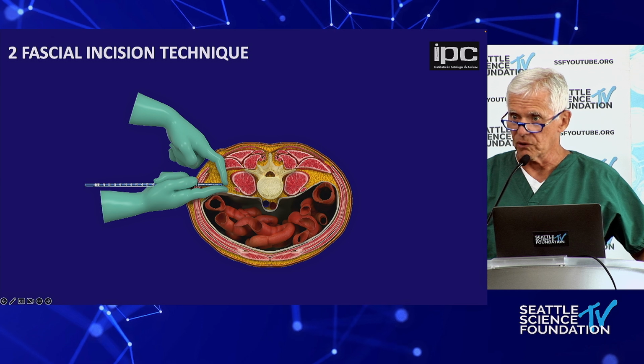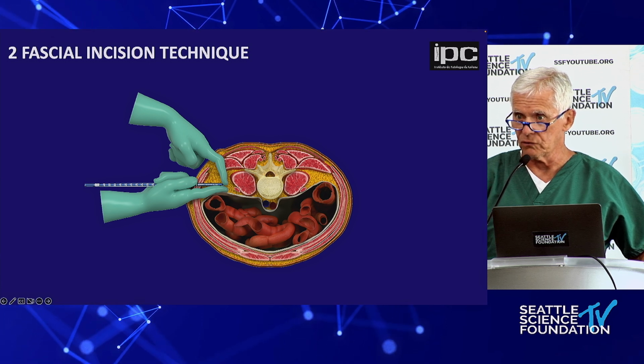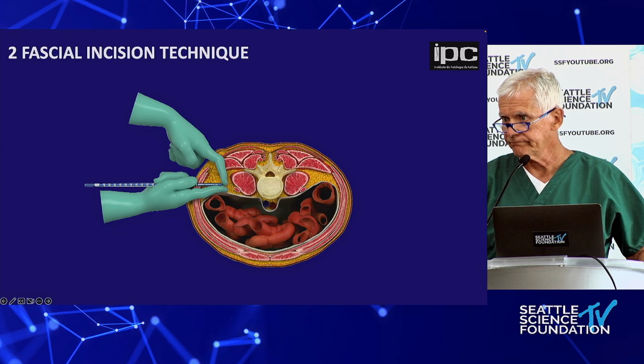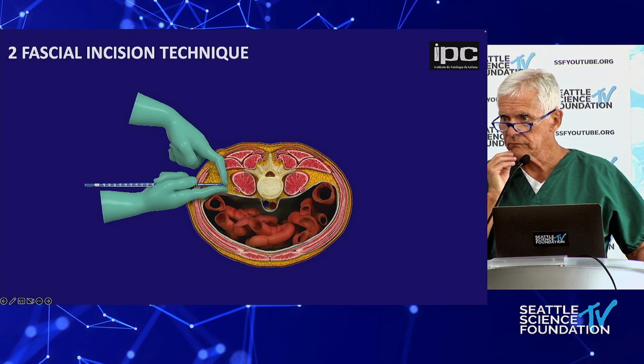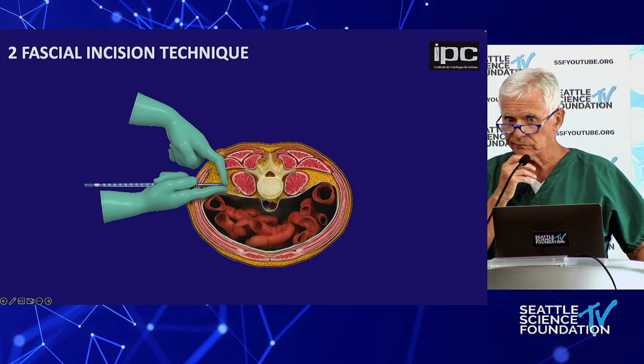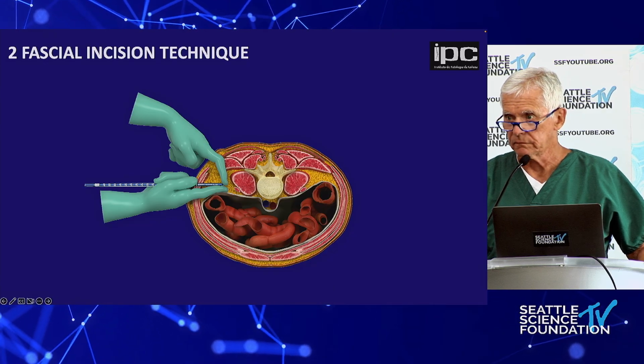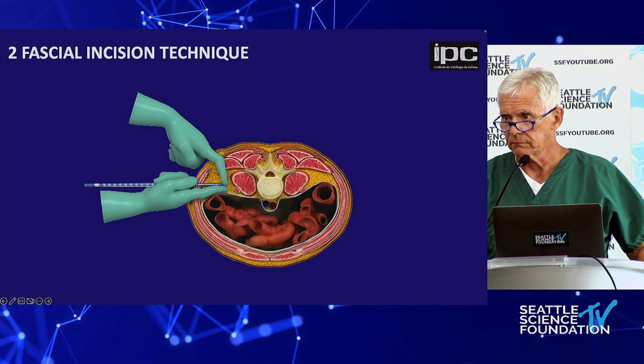You're always controlling the tip of everything that you drop to the psoas. Because this is being done blindly, if you feel something soft and squishy between your fingertips, you can always just rub your fingertips together, and if it's fat, it'll just efface.